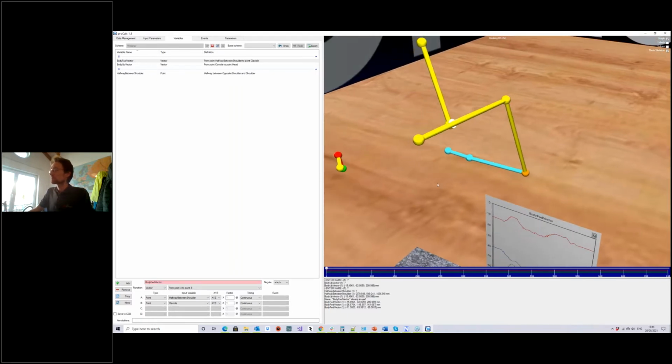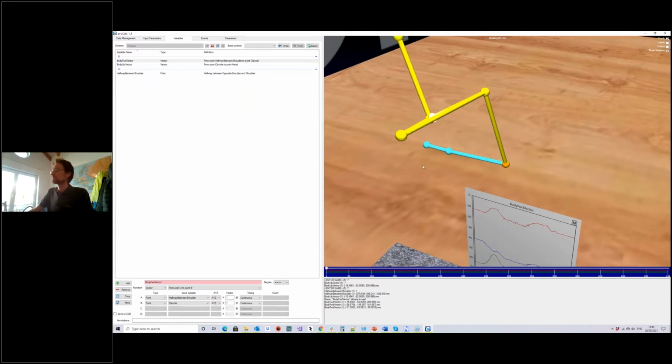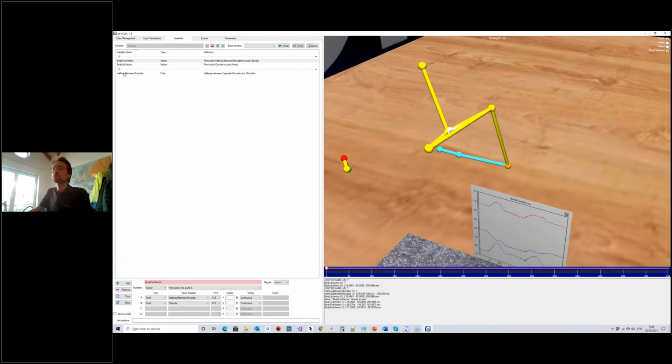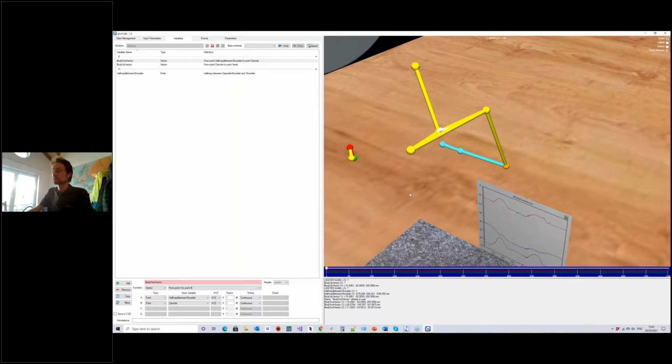This would be the exact opposite case if we had a left-handed person. So how do we solve this problem? This is when we start with some mathematical concepts, which I hope you are familiar with, because we are able to use what we call a vector dot product in order to ascertain this variable.